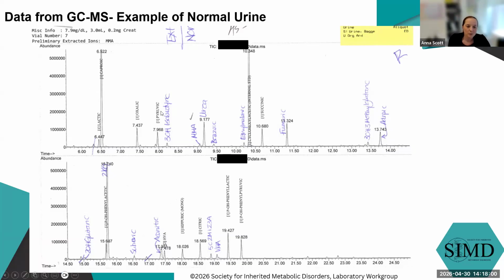Now, you'll notice some of these peaks are labeled with text and some are handwritten. Our computers have varying quality of compound identification, particularly since some of these peaks may not be 100% one compound. So this data is actually three-dimensional.